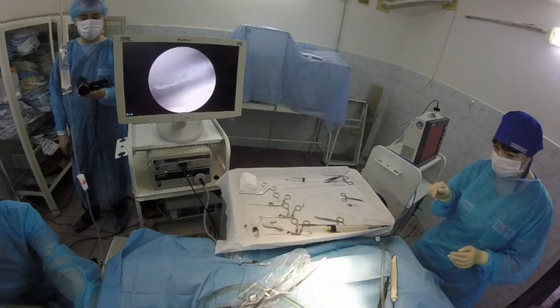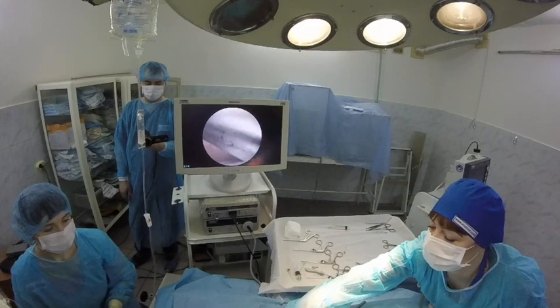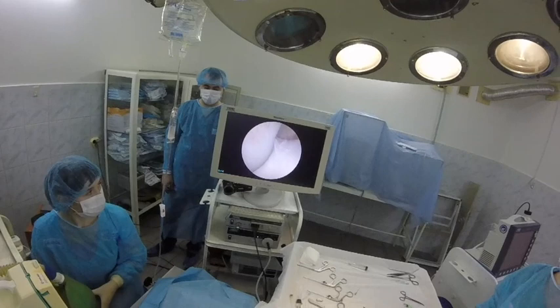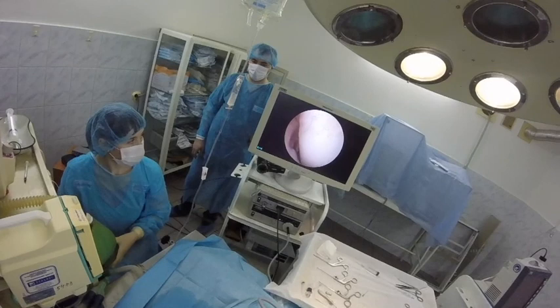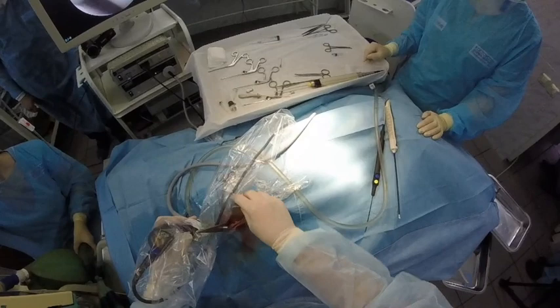Let's try to examine another part of the joint — the middle part of the glenoid, medial collateral ligament, as you see. Tendon musculus subscapularis is good. Ligamentum ovale is good. Tendon musculus biceps brachii is good. So all of the problem is in the caudal part of the joint.